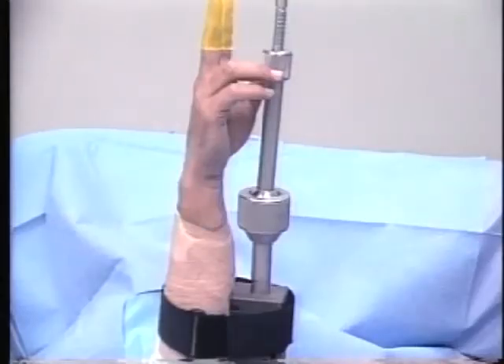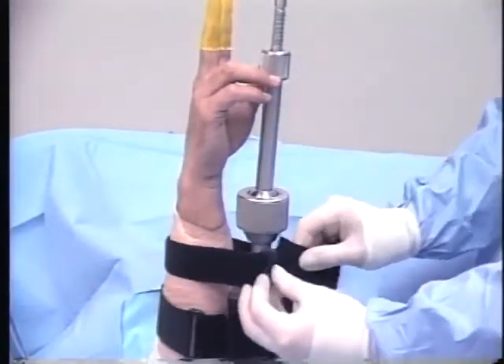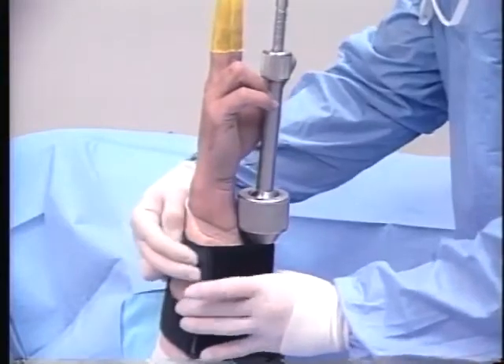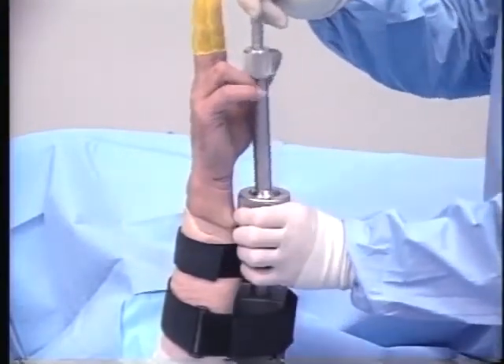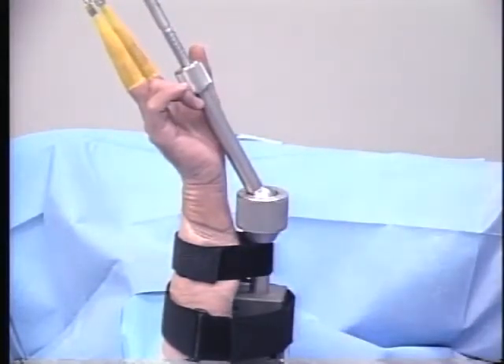Normal skin with this amount of force applied to two digits can accommodate this stress without difficulty for two hours. The wrist is stable in a vertical position and several options are available. A wrist strap can be added for additional stability. The ball joint can be loosened with a counterclockwise twist to allow wrist flexion, extension, or radial ulnar deviation.